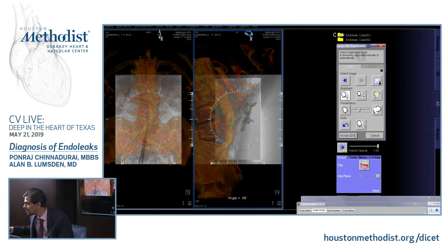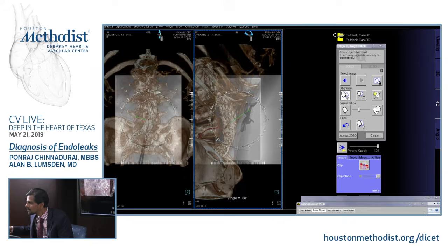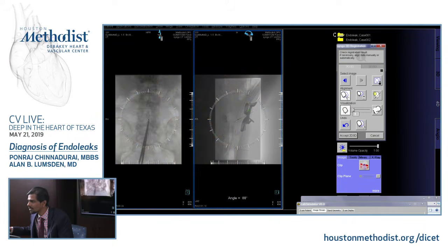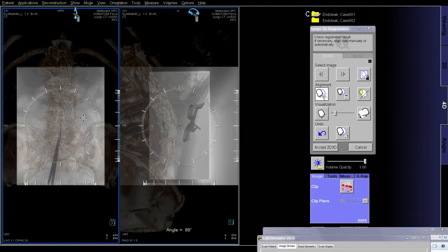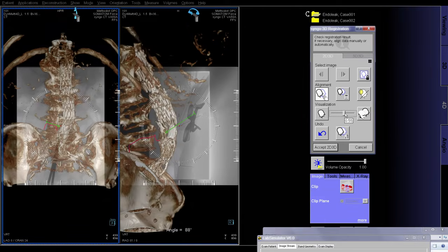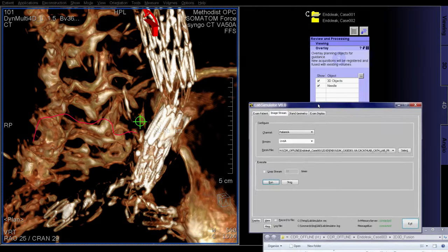So here you can see, if I bring the stent graft up a little more, now we are looking at two sets of data sets, right? So you have the stent graft marker and you have the stent graft from the CT matched with the fluoroscopic image. All right, before you get to the exciting part of us sticking a needle in here, let's take one more quick break.